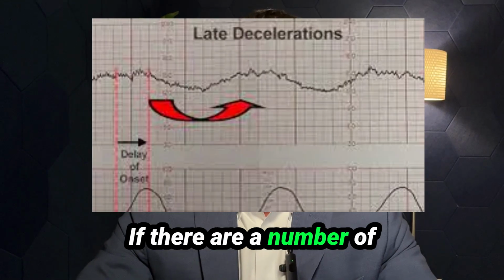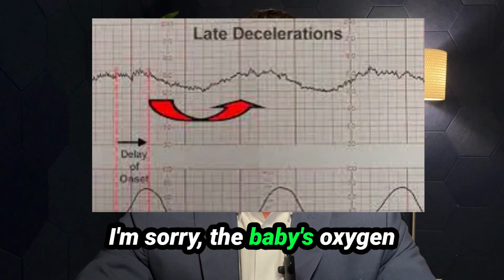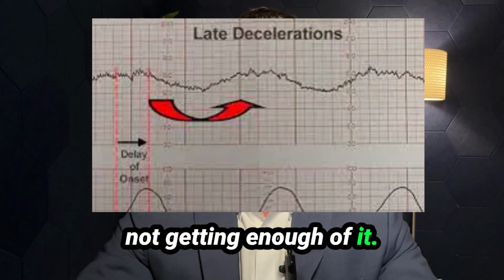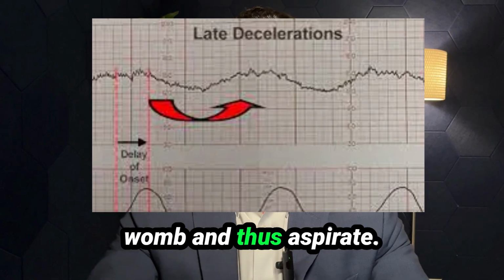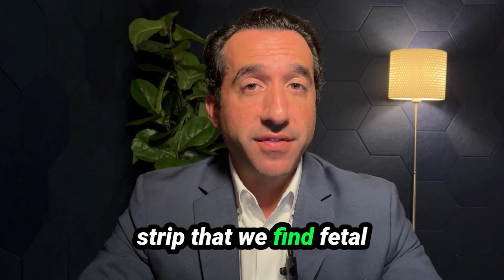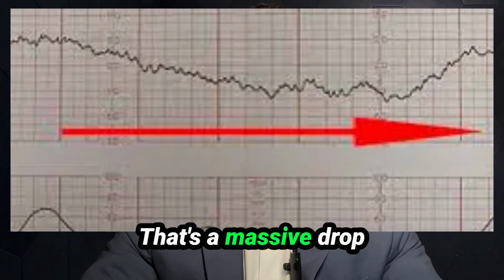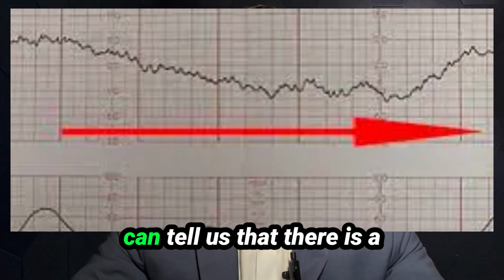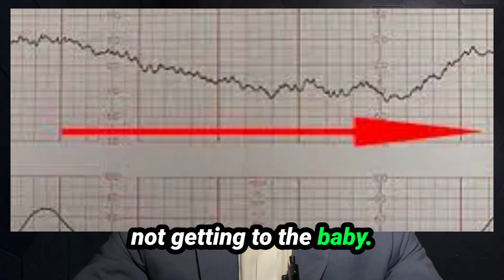If there are a number of those in a row, then we know the baby's oxygen levels are dropping and he's not getting enough of it. Therefore, it could release the meconium in the womb and thus aspirate it. The second way on a fetal strip that we find fetal distress is what's called prolonged decelerations. That's a massive drop in the heart rate after a contraction. Those can tell us that there is a massive amount of oxygen not getting to the baby.